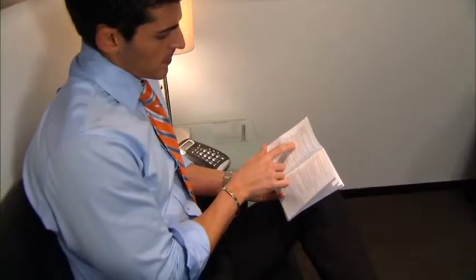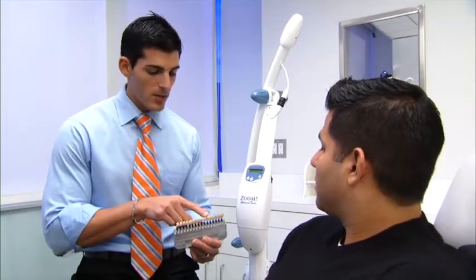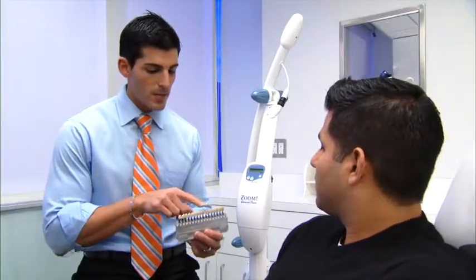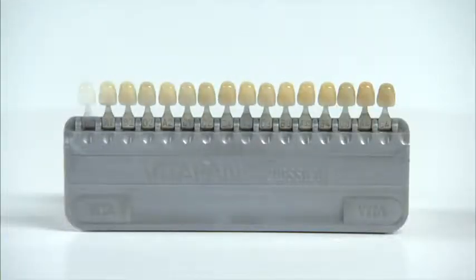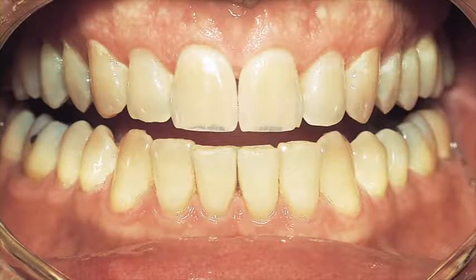It is important to set realistic expectations about potential whitening results. Explain that results may vary. However, most will experience a 6 to 8 shade change. Anatomy, calcifications, age, teeth condition, and oral hygiene determine the results each patient will attain. Patients with yellow staining tend to whiten best.